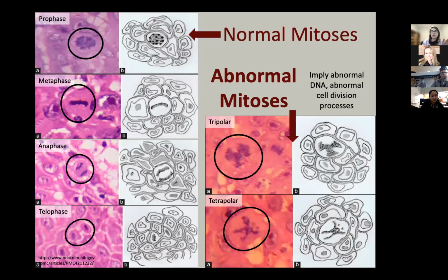I will make an additional word, however, on mitoses. Mitoses that are morphologically normal. So, go back to grade school, right? Even prophase, metaphase, anaphase, telophase. All of these morphologies of nuclei are normal and can be seen in benign lesions, in hyperplasias, in malignant lesions.